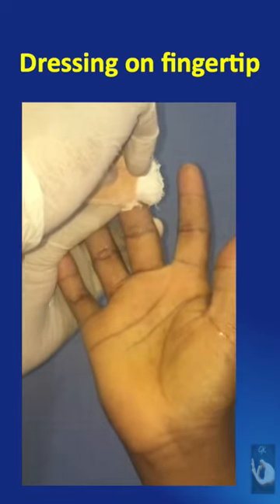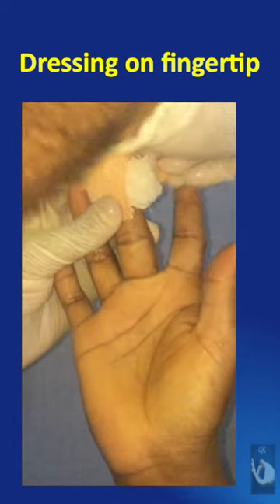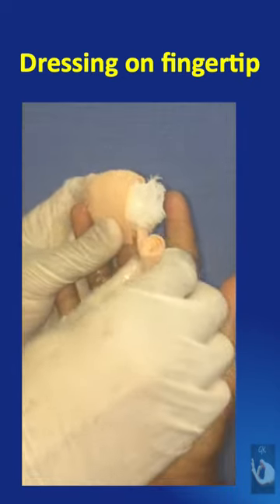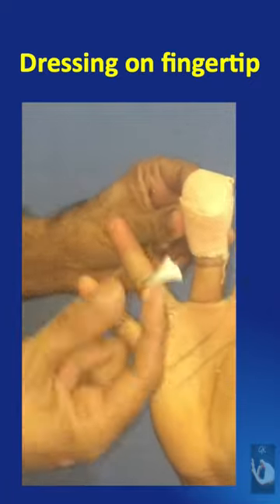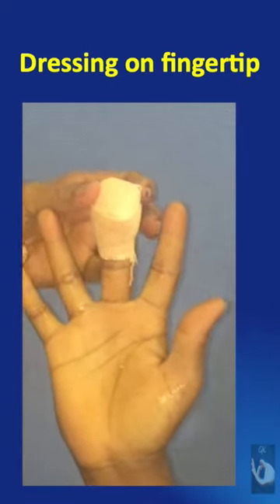Holding this gauze piece, a finger elastocrat bandage is applied starting from the volar side, over the tip, and then going around the finger. This compression should not be too tight. The end must be secured with a short 1 inch micropore plaster that should not be circumferential.